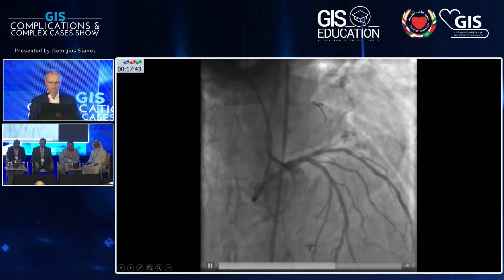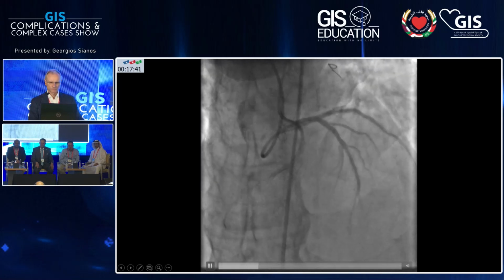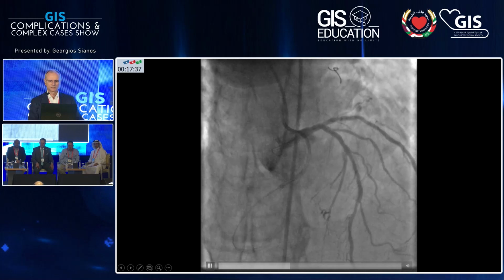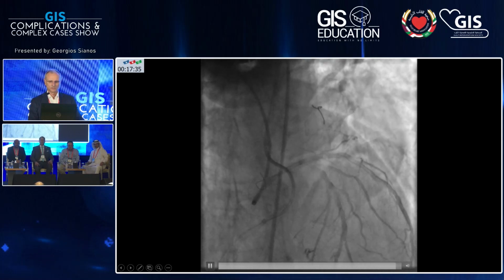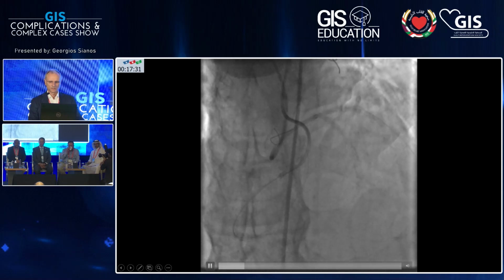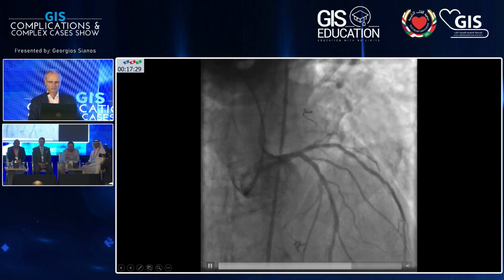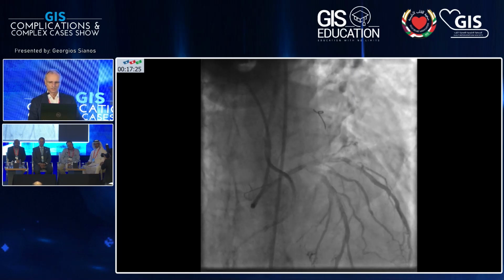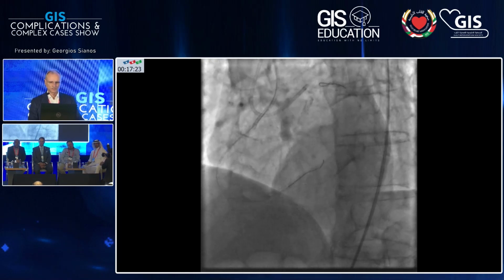It was not very visible in the angiogram, but the wire from the PLA reached this collateral, as you can appreciate. At a certain point, you can see the epicardial collateral course and the course of the wire. So the wire is not in full alignment, crossing close to the circumflex.